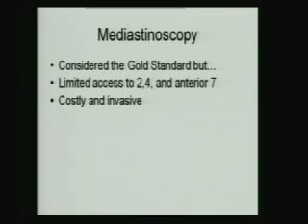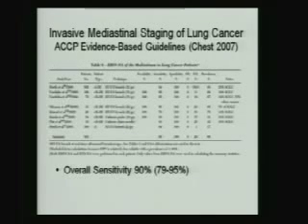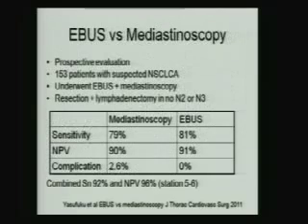So we started this talk by saying that mediastinoscopy is the gold standard for staging the mediastinum. However, it seems we have a good contender here, with many studies showing very high sensitivity comparable to that of mediastinoscopy. So it was very logical to perform a head-to-head comparison.